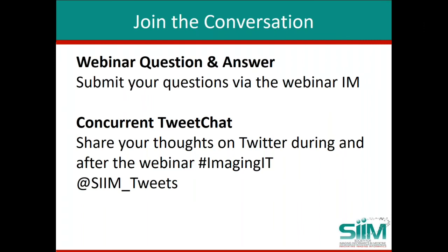Our first question comes from Akram Mohammed to Chris for the OHIF project. Is it possible to embed this OHIF viewer from another GUI web app? Yes, it is. It has a URL launch interface, and you can also do a deeper integration.